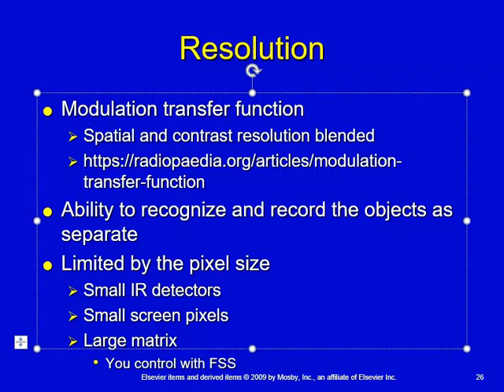They used the exact same matrix size between small image receptors and large image receptors. So image receptor size in CR determined the resolution. The smallest image receptor size you could use gave the highest spatial resolution.